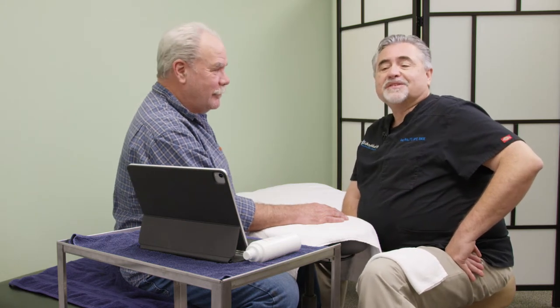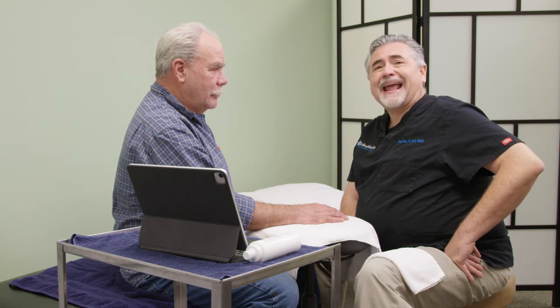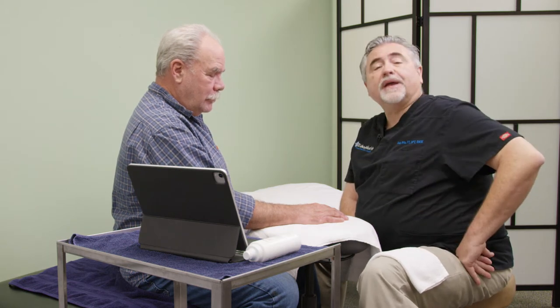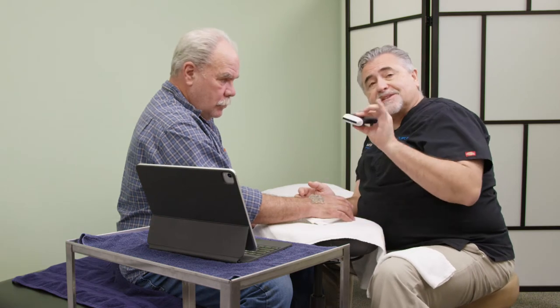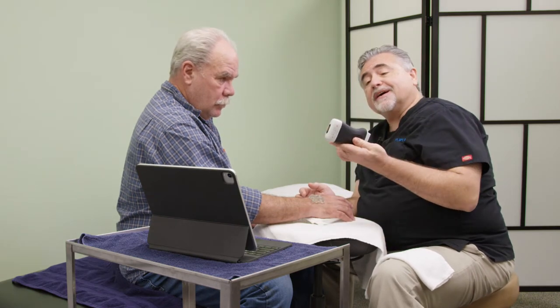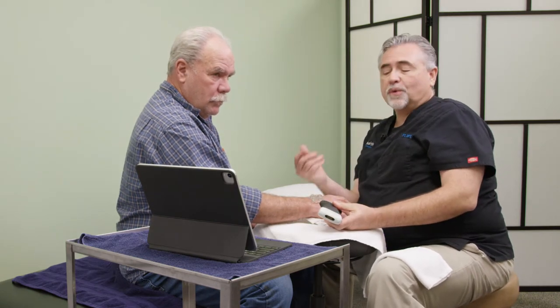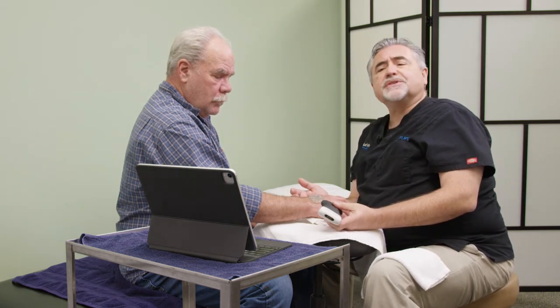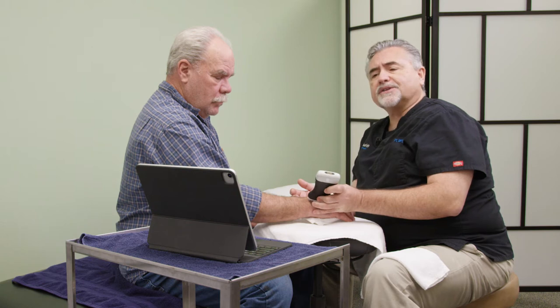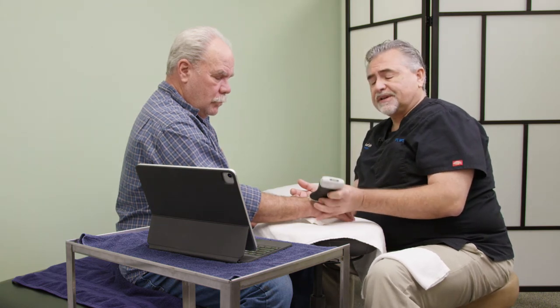Recently Randy has been dealing with some building wrist pain. I'm fortunate in my practice to have access to the scanner from Clarius, which will allow me to take a window into his wrist and look at the bony, ligament, and soft tissue structures, and certainly identify areas where inflammation exists.